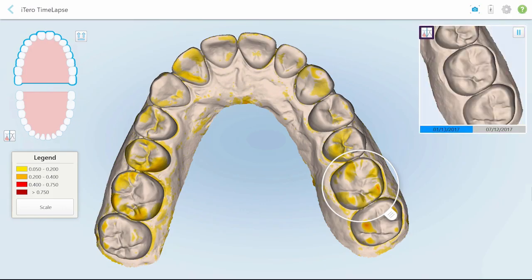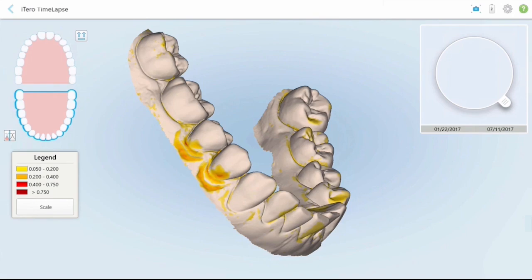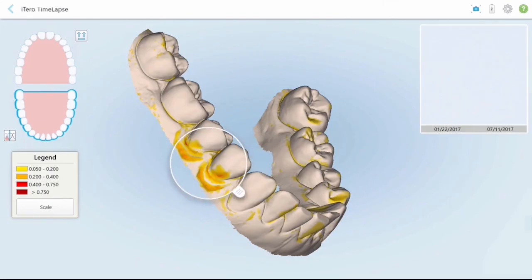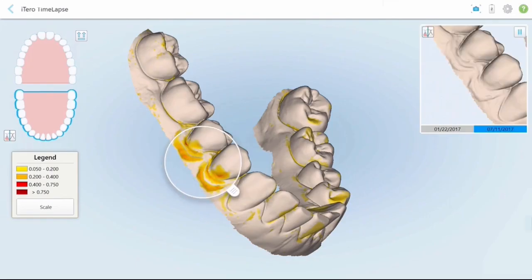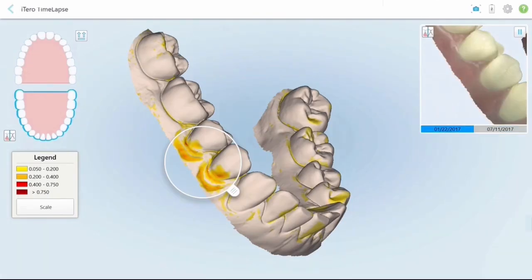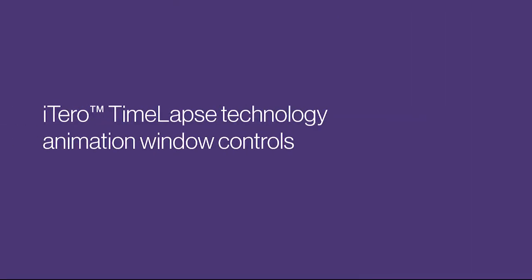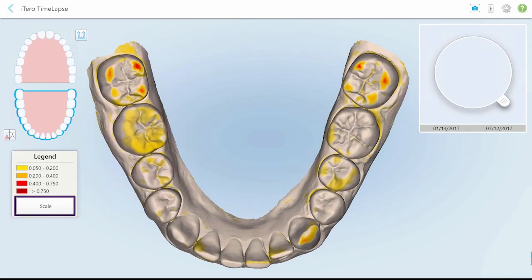Tap here to alternate between monochrome and color modes. Tooth movement is also visually apparent when using the iTero time-lapse technology. Differences between scans that may represent soft tissue changes such as recession or growth can also be visualized.